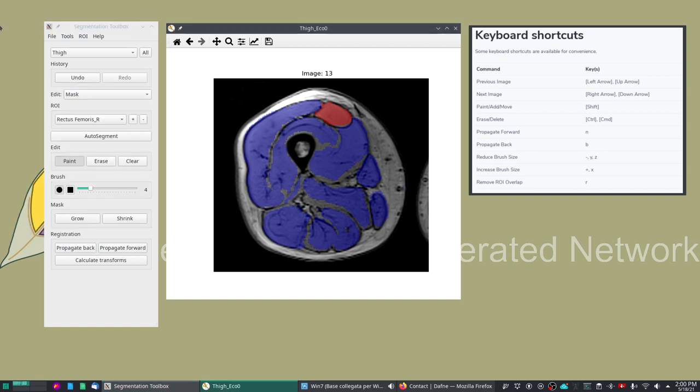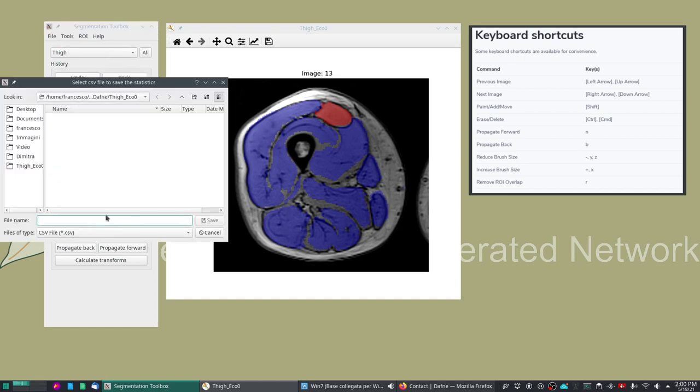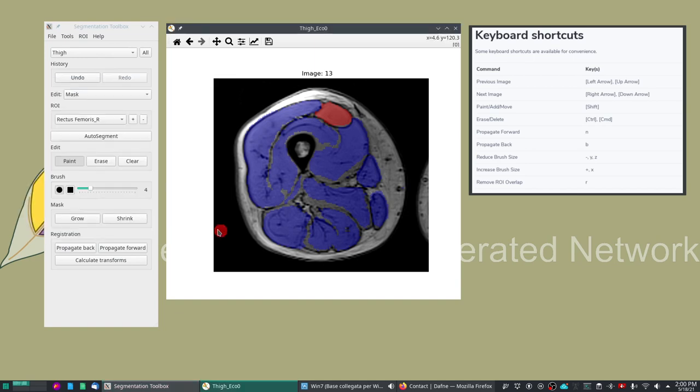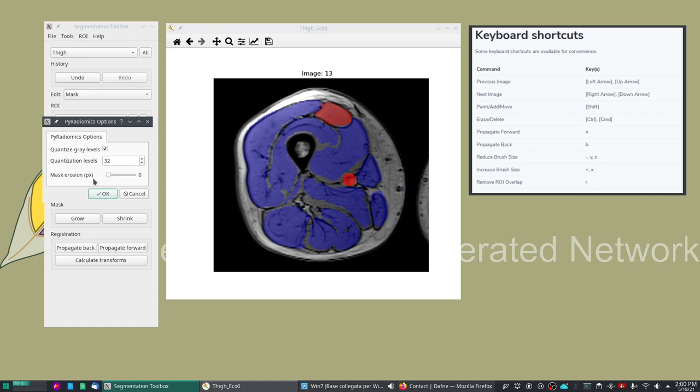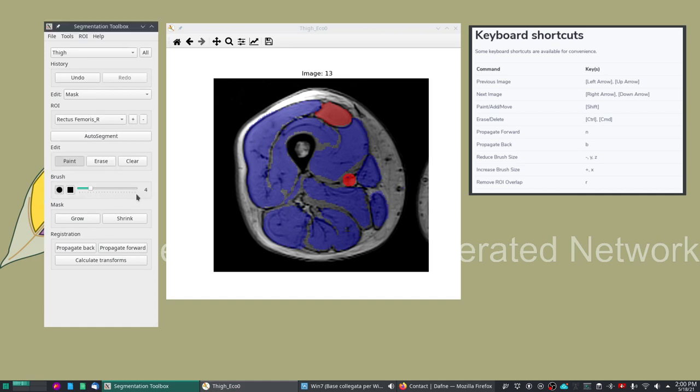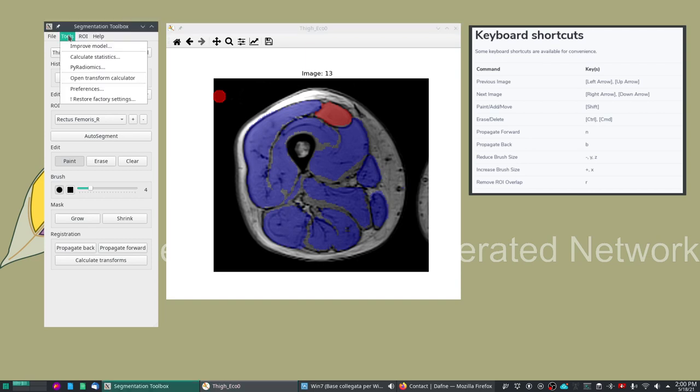Other possibilities that you have: you can calculate some statistics and this will save a comma separated value file that includes the volume for each ROI, the average gray level value for each ROI and some other statistics. Or you can also use pyradiomics feature calculations and here you can specify a couple of settings and you can extract the texture analysis indices for every ROI that is defined.